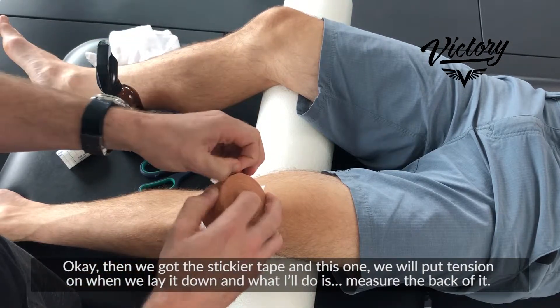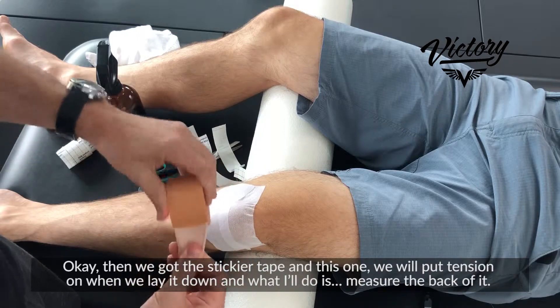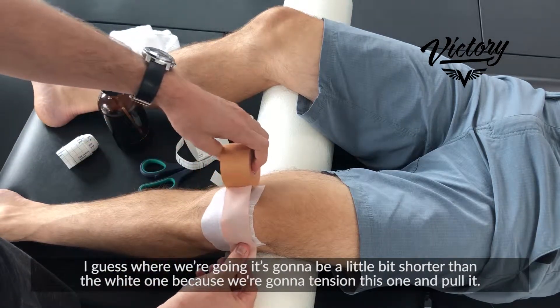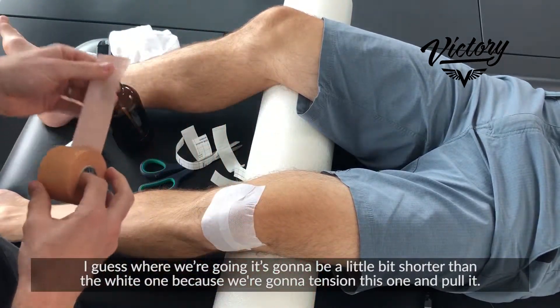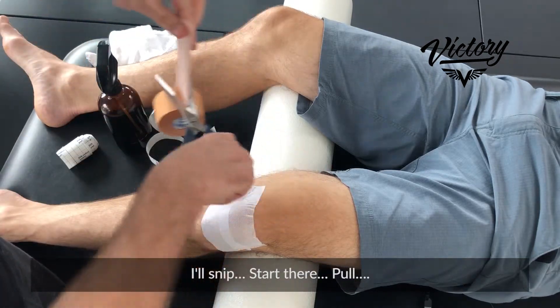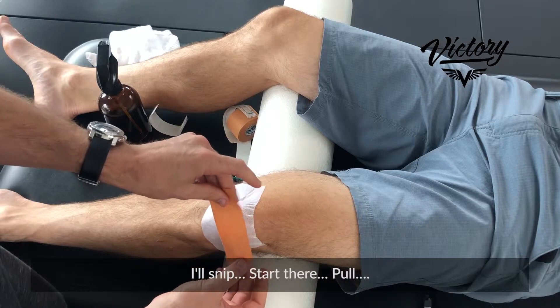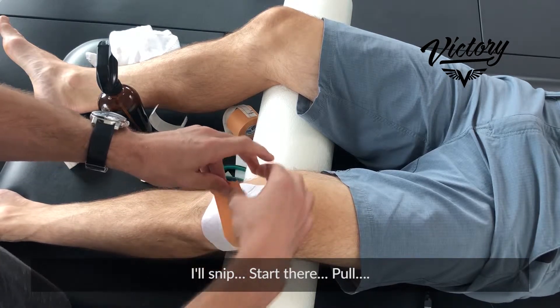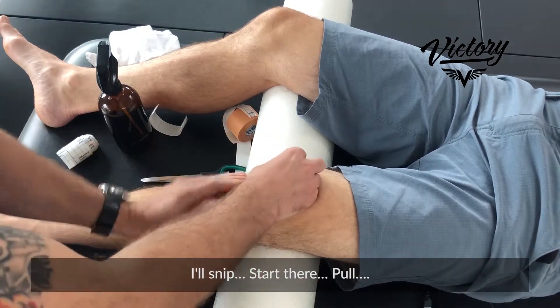Now we've got the stickier tape, and this one we will put tension on when we lay it down. I'll measure it — it's gonna be a little bit shorter than the white one because we're gonna tension this one and pull it. Snip, start there, pull — boom.